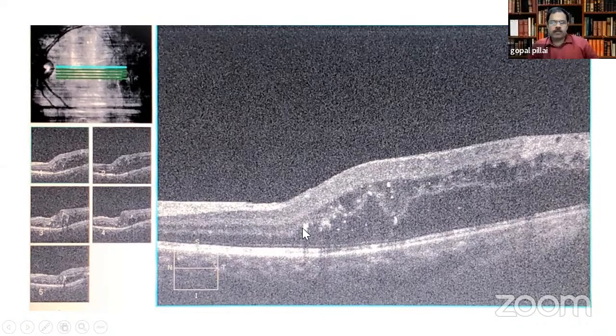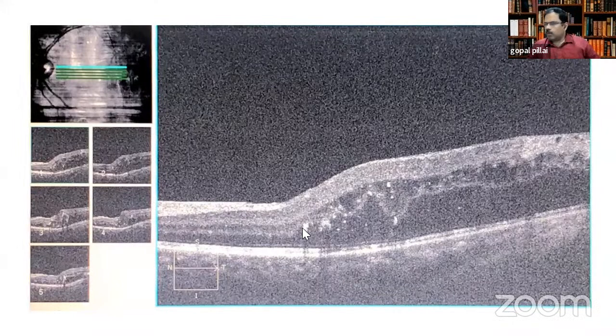Next slide. I think that's all. Okay, that brings us to the end. I think we have looked at somewhere around 15 to 20 OCTs, going through epiretinal membrane, macular hole, vitreomacular traction, AMD, diabetic retinopathy, retinal vein occlusion, cystoid macular edemas, and finally diabetic retinopathy.